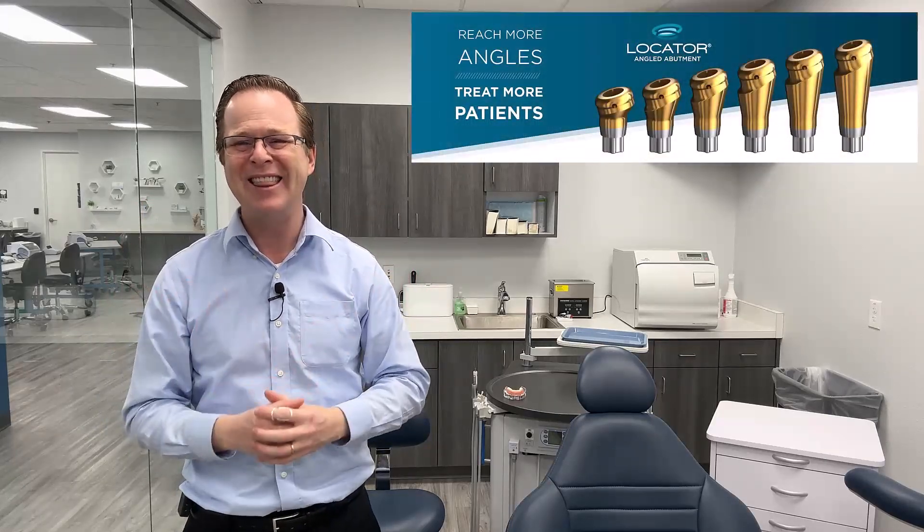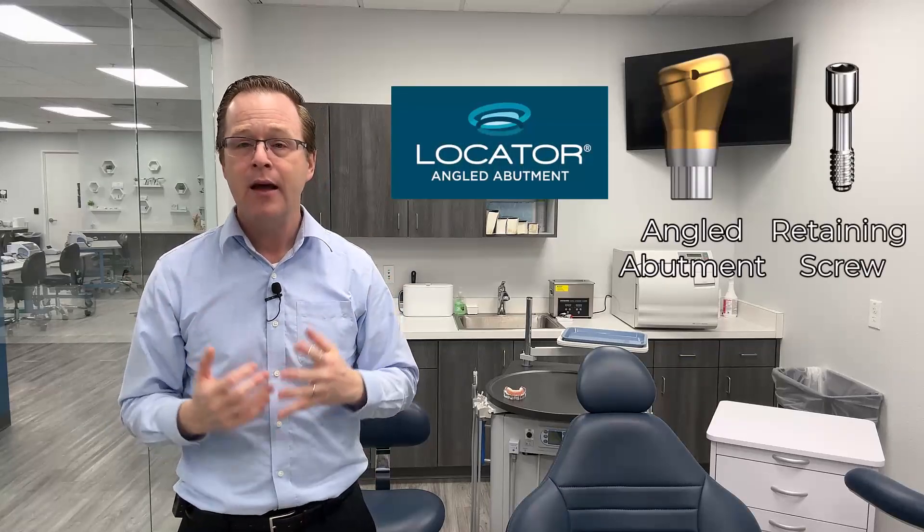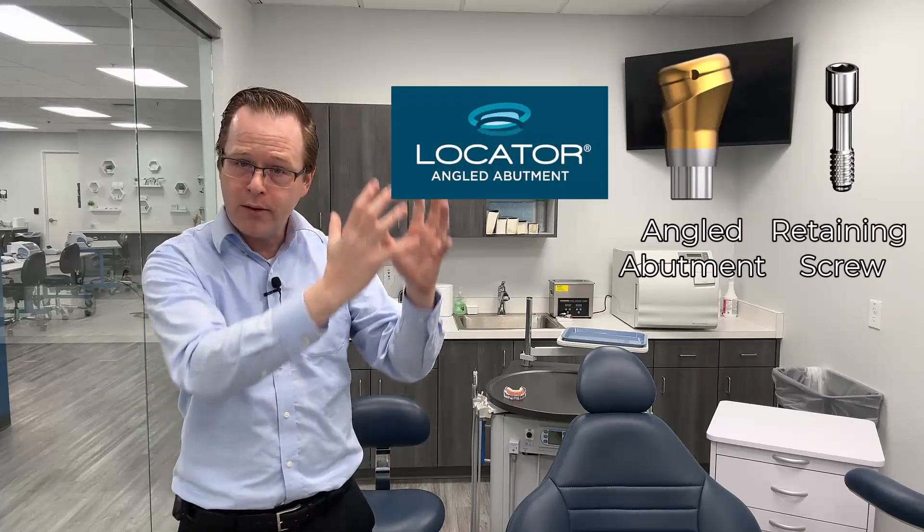So the industry and professionals — dentists, technicians — we've spoken, and we said we need an angled locator. And that's here. It's a two-piece abutment. It has the standard titanium nitride abutment, and it has a titanium retaining screw that allows us to place our implant in multiple positions.